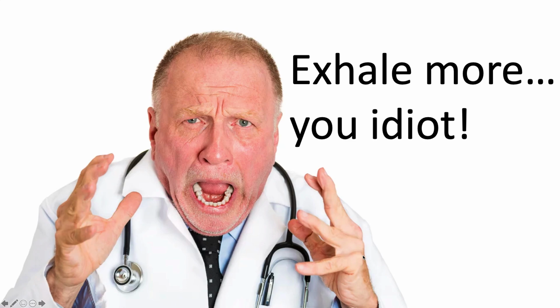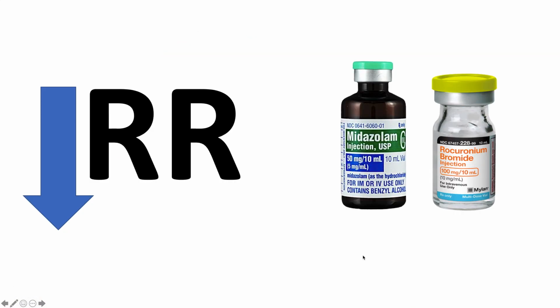So how do we do this? We can't just yell at our patient and make them do it. So we have to have a couple different maneuvers. Now, there are some advanced maneuvers you can do on the ventilator to change inspiratory time and fancy stuff, but I think that's beyond the scope of this. The main things we need to focus on are decreasing our respiratory rate and thinking about sedation and paralysis.